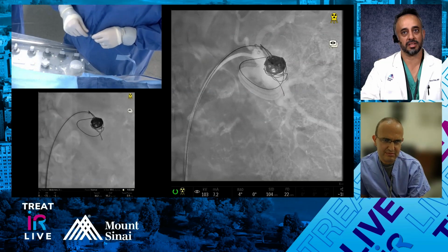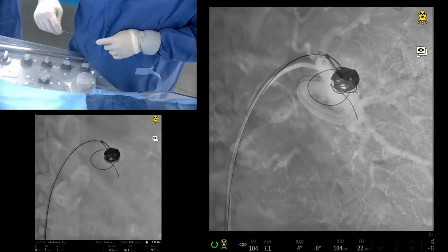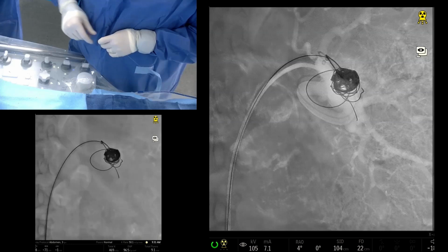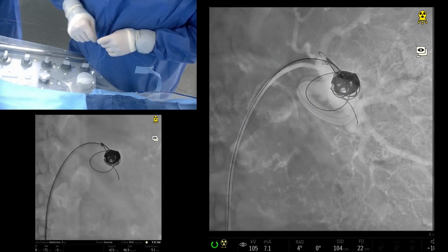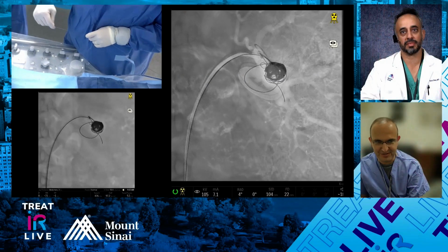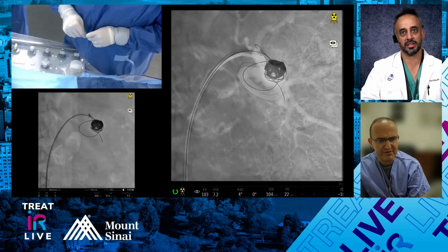I'm just going to try and reposition micro. You think it's a big deal that it's flipping in here? I think it's worth it. There it is. You've been doing this just like that. Yeah, perfect.